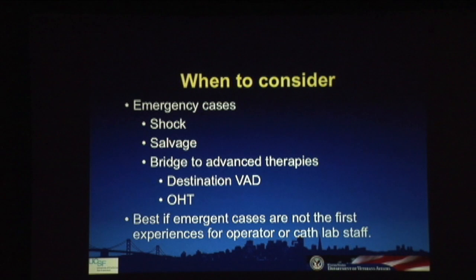So when do we consider support? Well, first we've heard discussion about the shock patients, the salvage patients, salvage being patients who've had CPR, a huge predictor for bad outcomes. As a bridge to advanced therapies such as destination VADs or orthotopic heart transplant, those are times to consider support. As an operator or as sites that might be putting these in and transferring them, these are not necessarily the best cases to start out and learn how to use the device, especially for the staff and everything. Things have to move very quickly in acute STEMIs and so on.